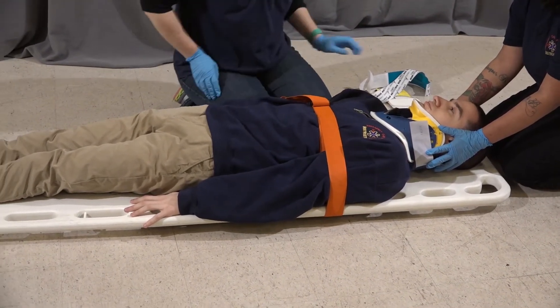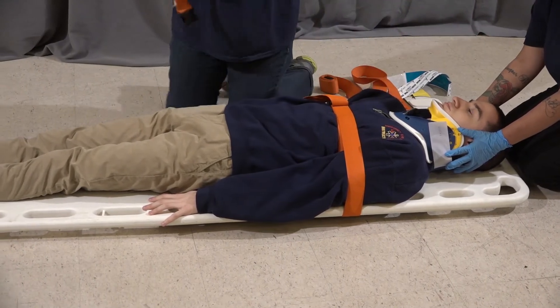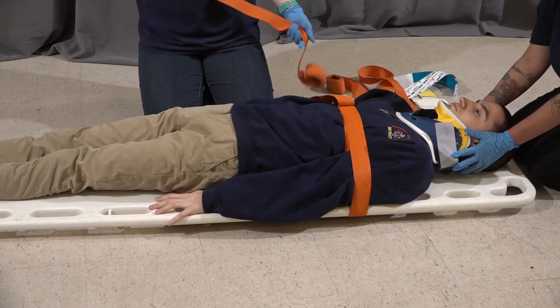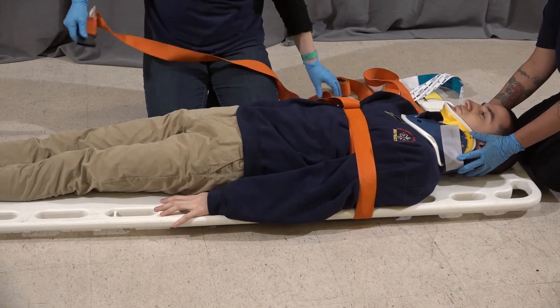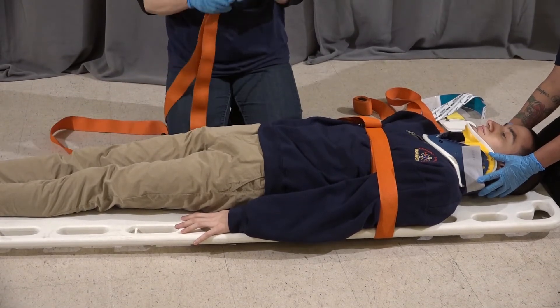Take away your extra tape. We're going to move down to the hips, making sure you're on a bony portion. We're going to repeat. When we do this, we're going to make sure we catch the hands in the strapping.